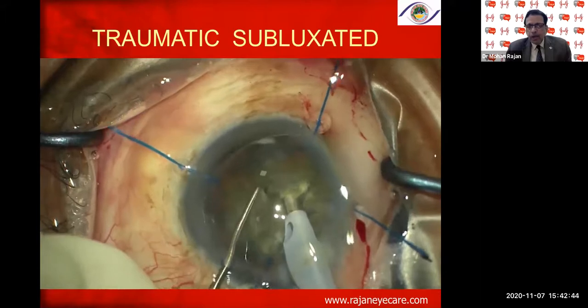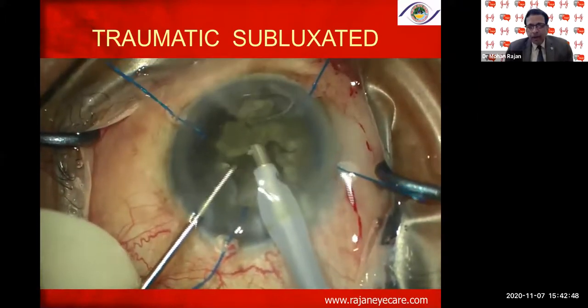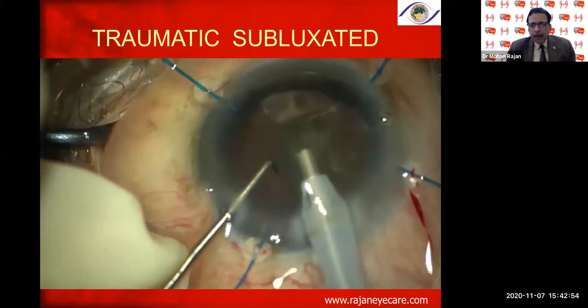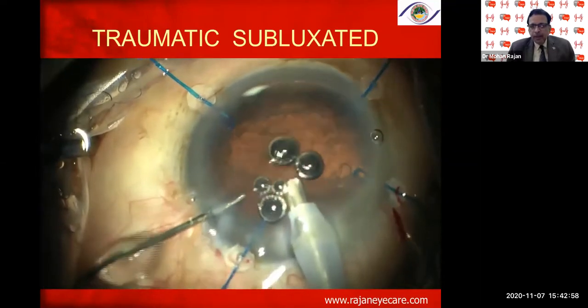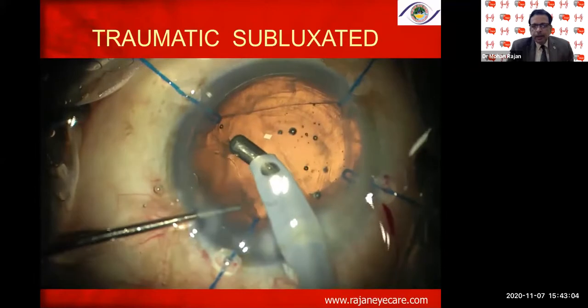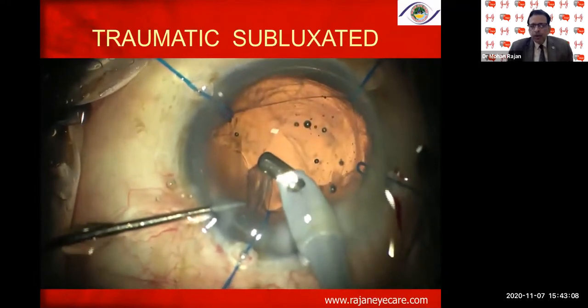If you're going to use the iris hooks for the capsular bag, make sure you don't keep them for a long time. So you can see here I'm going ahead with the phaco emulsification without any problem at all, injecting viscoelastic now and then into the anterior chamber. Injecting viscoelastic again, and you notice the iris hook at the lower left. I should have removed the iris hook at that time.